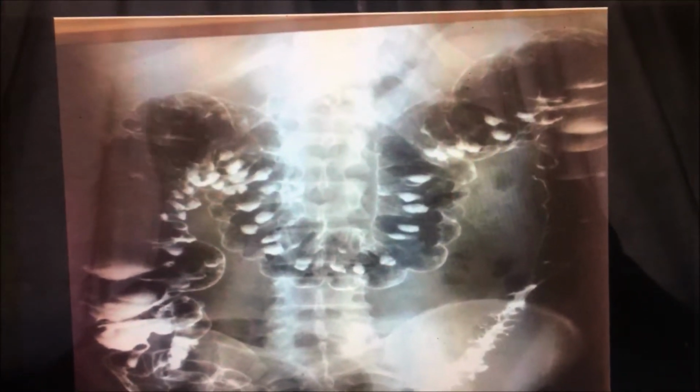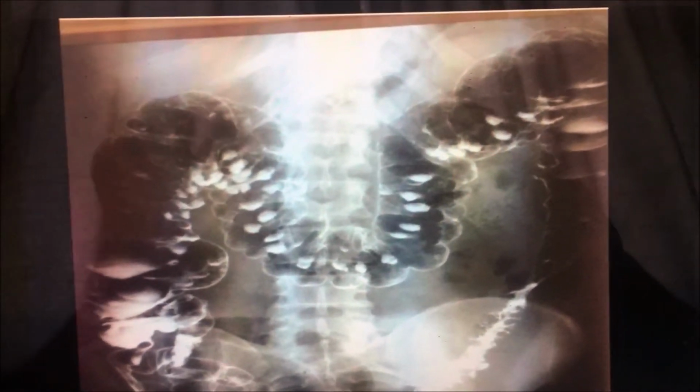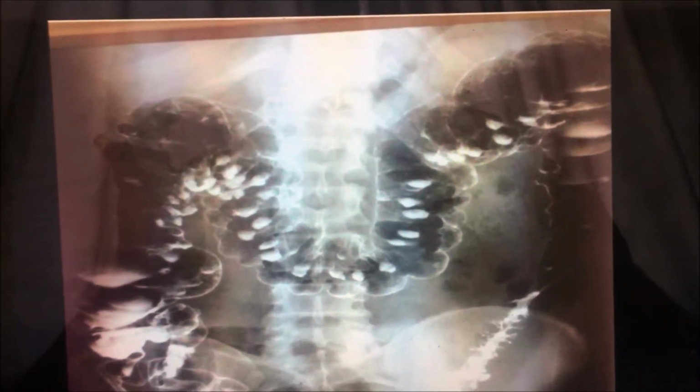You see where the air goes up, the barium stays down, and you can see where the pouches are, because the barium gets stuck in the pouches. Like I said before, it's a complication of diverticulosis, and the images are a little bit similar. It's just a more severe complication of diverticulosis.